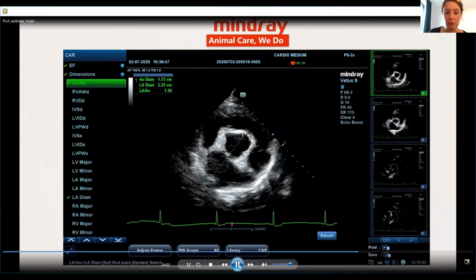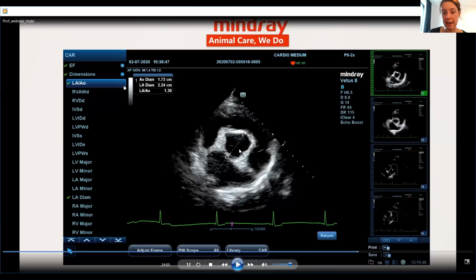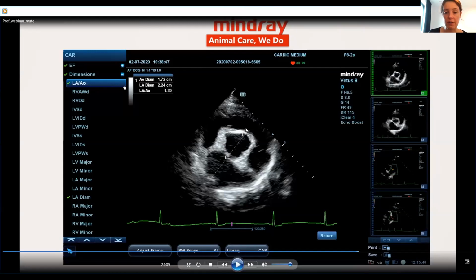So basically what you are doing is we are measuring the inner diameter of the aorta, and you cannot really see it really well in this image, but what you actually do is you follow the line between the aortic cusps, and it's between the non-coronary and the right coronary cusp that you are following the line. But I've watched, of course, the 2D image, and I know from the 2D image where the line between the cusps is running. So we orient on this line between the cusps, and then we start with the internal diameter of the aorta, and then we follow this line for the left atrium and we measure the internal diameter of the left atrium.